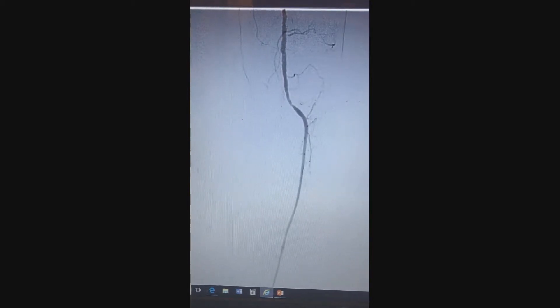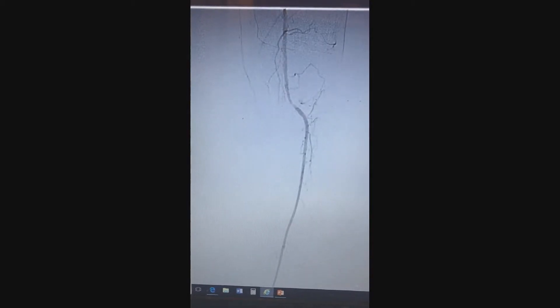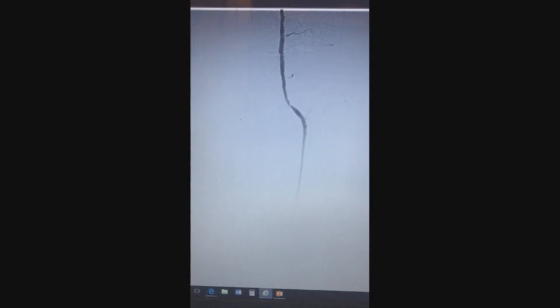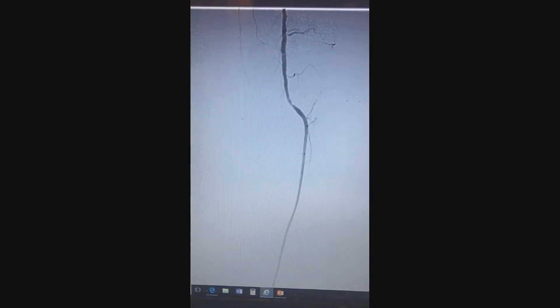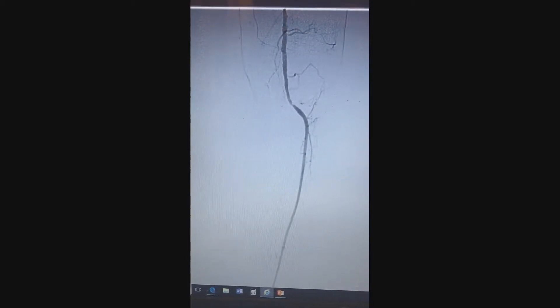The plan at that time was to wire the anterior tibial and try to see if we can recanalize the tibial peroneal trunk as well. This is the rest of the vessel, the anterior tibial. You can see the communicating artery that shows the peroneal. Not much of the posterior tibial is seen.